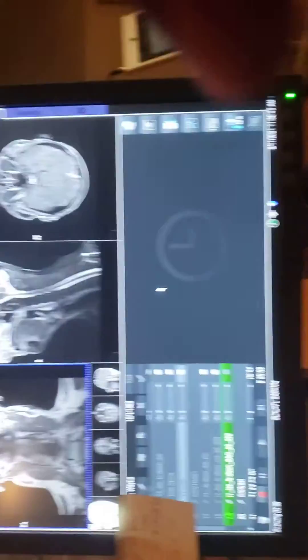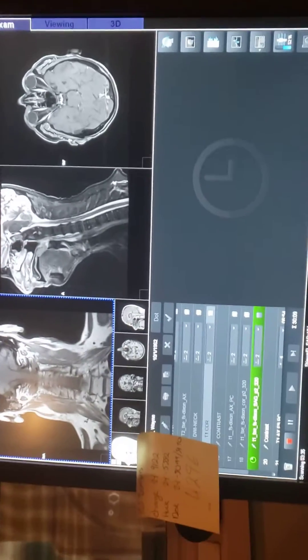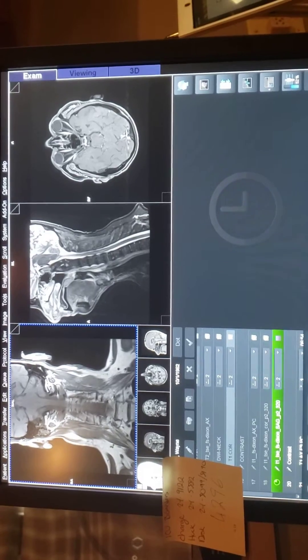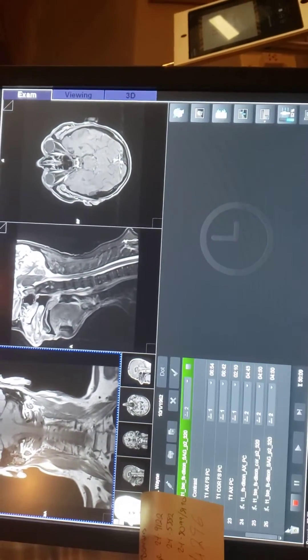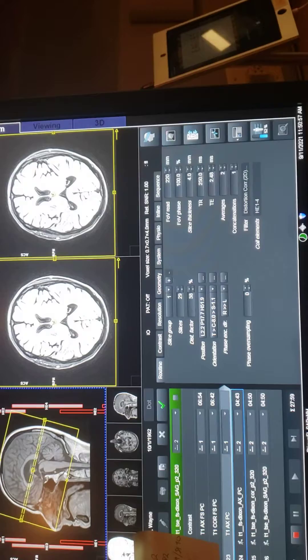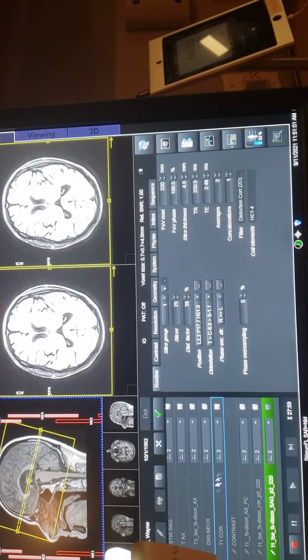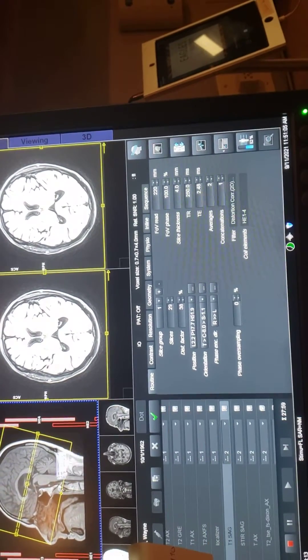This one here is a soft tissue neck scan. It's pretty much including everything — I usually do the top of the ears. This is how I do it.